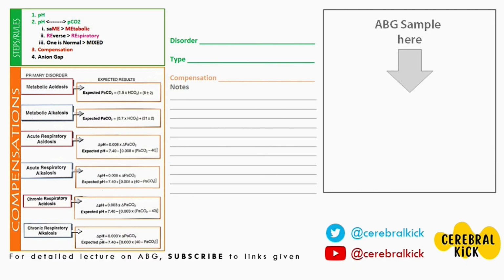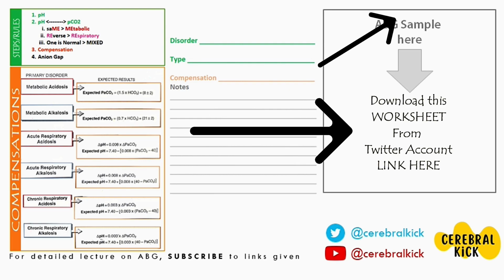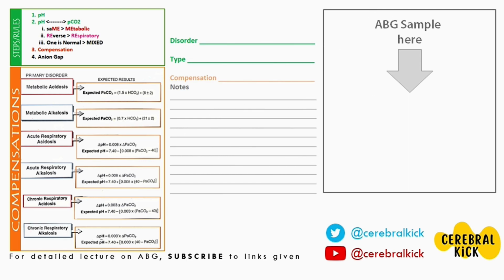Now, these were a few ABGs. I started off with the simple ones and ended up with the complex ones. I hope you've got the idea of how to interpret the ABGs. Just take the worksheet and practice it on different ABGs in your ICUs.